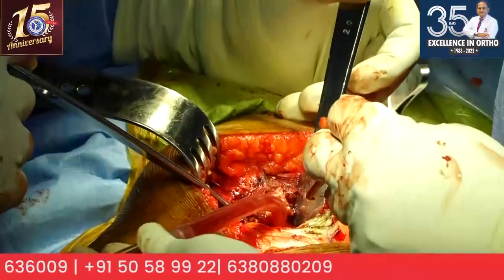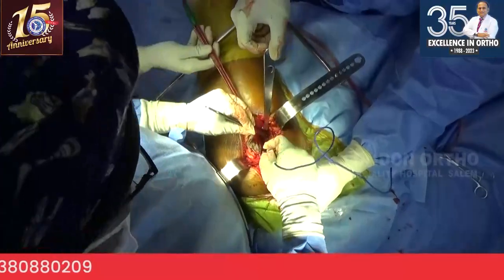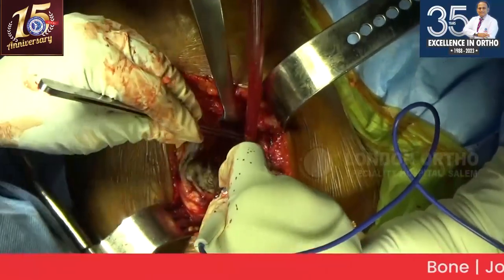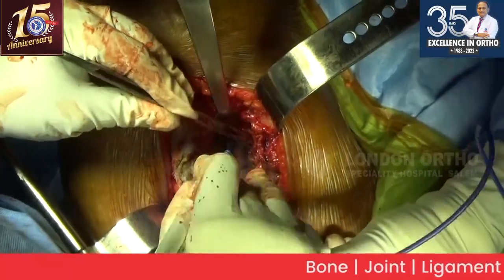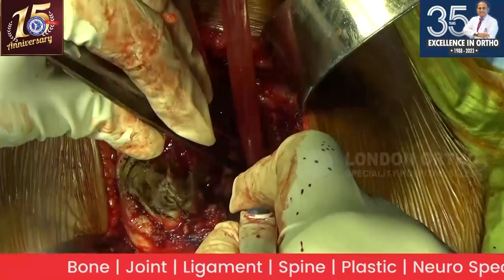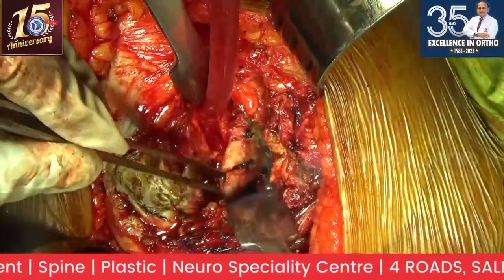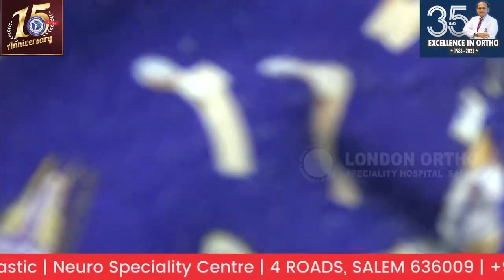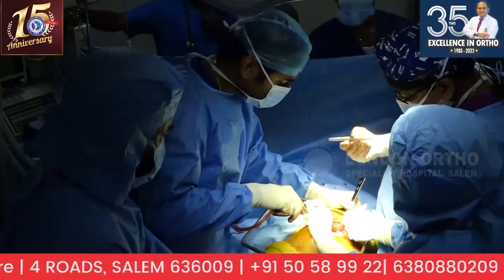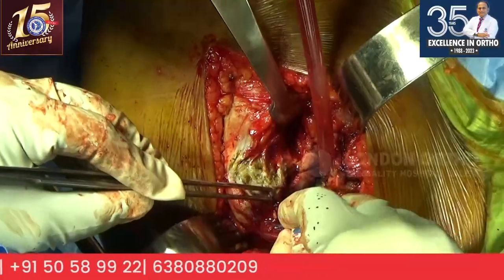I have just incised all the way up to 11 o'clock, clockwise from here. And that's the labrum, so I incise the labrum. In a routine case, many times I don't remove the whole of the labrum. I just want to remove the labrum to see what I want to see. In this case, I may have to remove more than what I usually do. So I just make multiple tiny incisions.